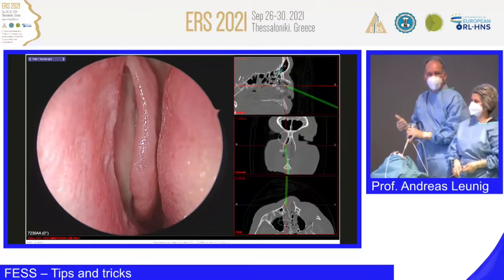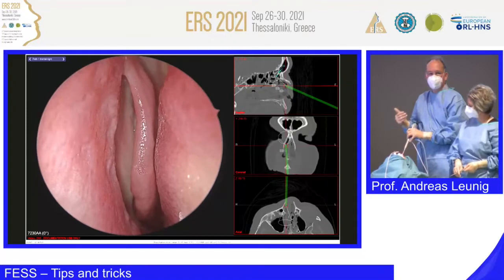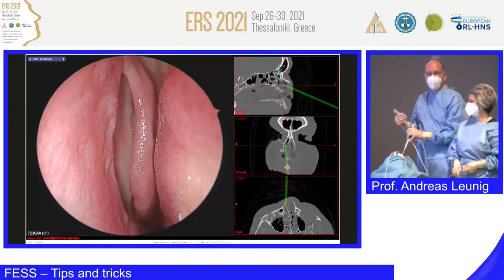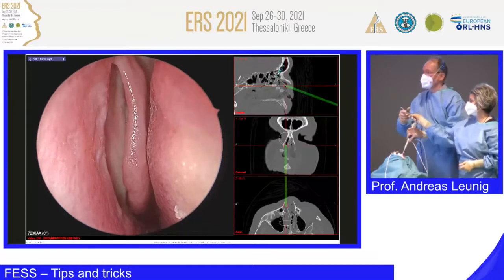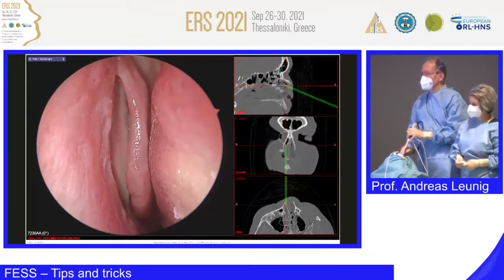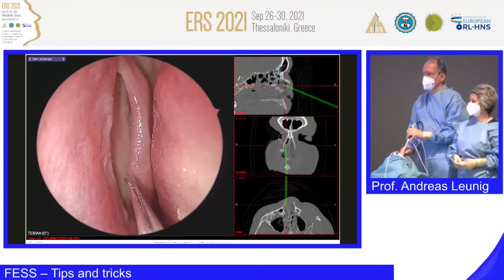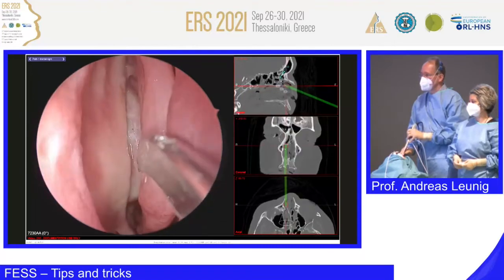We are talking about the concept of functional endoscopic sinus surgery. Spare as much mucosa as possible. Now, give me the sickle knife. Now, when we do the first steps for the resection of the uncinate process, you gently look again in.